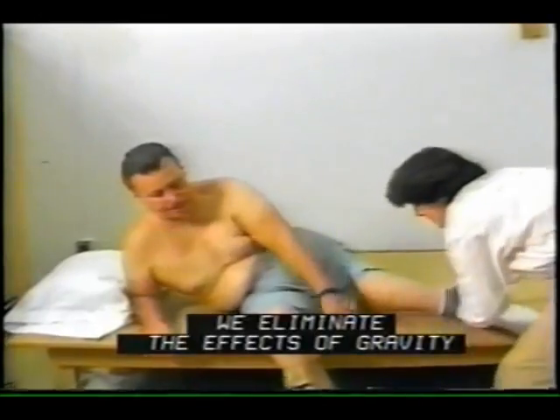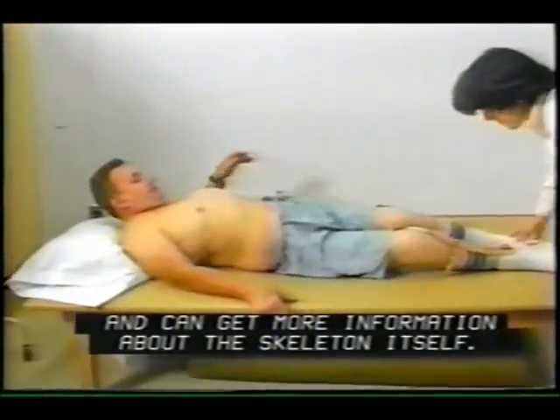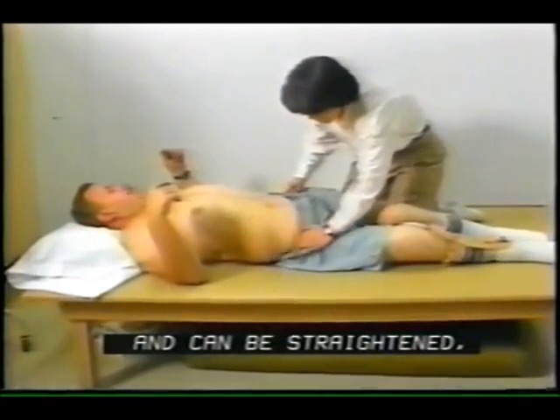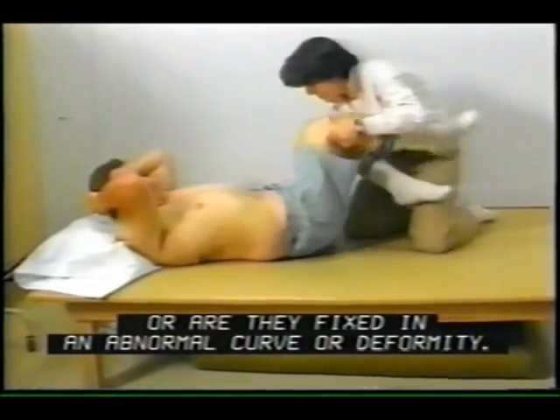By examining Steve lying down on a mat, we eliminate the effects of gravity and can get more information about the skeleton itself. We need to know if the underlying structures are flexible and can be straightened, or are they fixed in an abnormal curve or deformity.